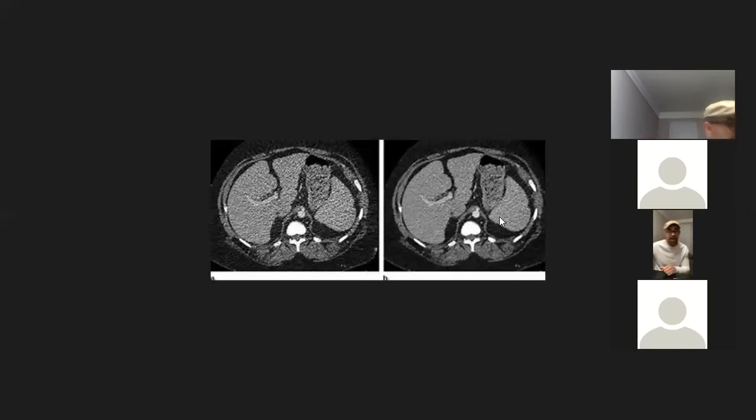They're using more mAs on the right. And more mAs equals more what? Like more photons. Exactly. So more mAs means more photons, which also means more signal.